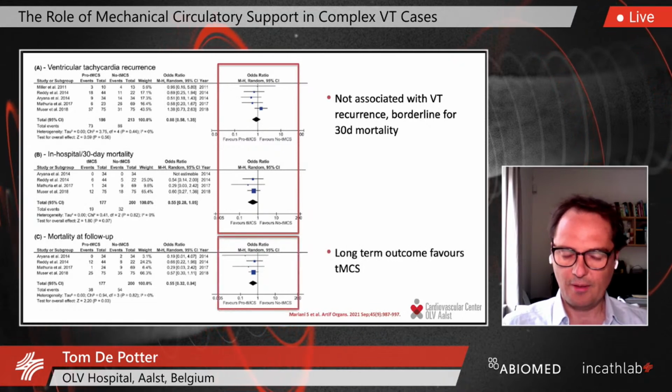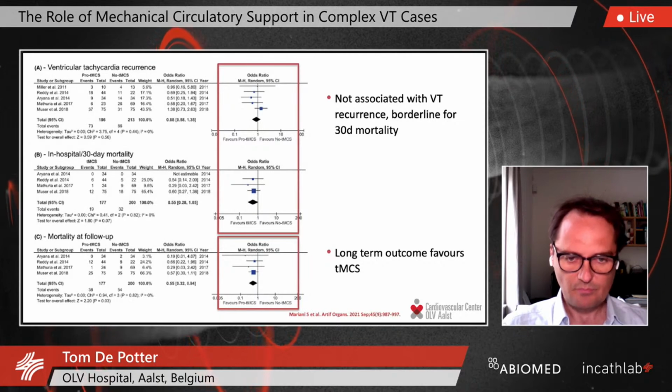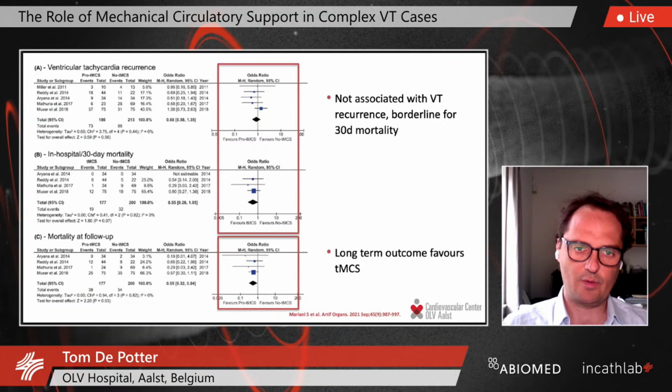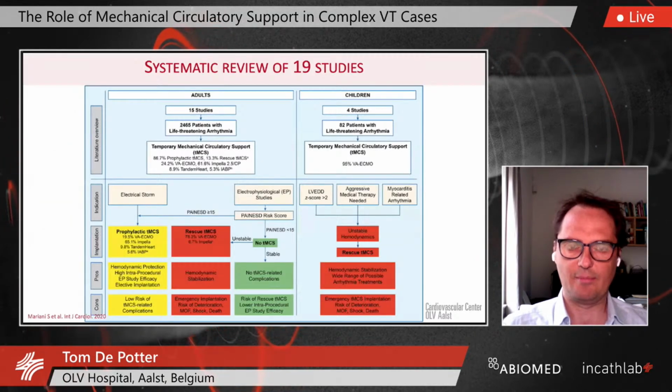At long-term follow-up, the difference becomes significant. In this meta-analysis, a significant outcome benefit was shown for the use of a mechanical support system, of course, in non-randomized settings, of course, not having the benefit of a randomized study.